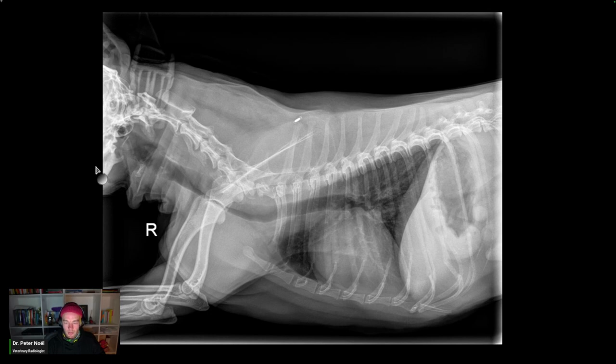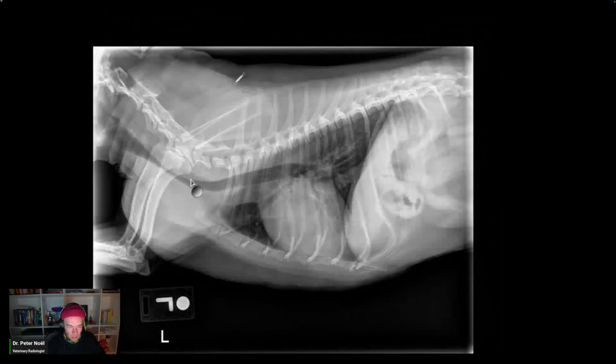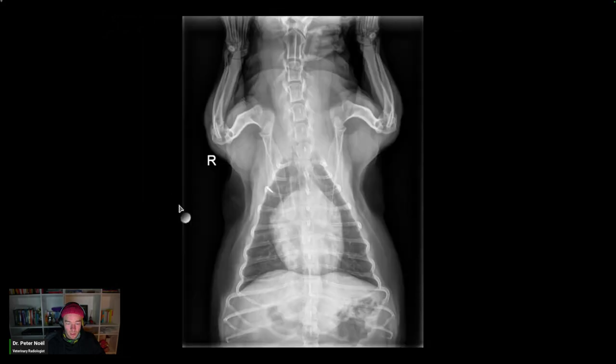First thing I do is, we talked about positioning and all that. We don't need to go into great detail. This is too much up here. The thoracic limbs are kind of pulled forward, blah, blah, blah. These are pulled forward. This is pretty good. Most docs, you're not helping, you're not sedating these dogs. You're giving your techs not a lot to work with. This is a pretty straight radiograph. You see these spinous processes right here, right on midline? Right here, they look like teardrops, pretty straight radiograph.